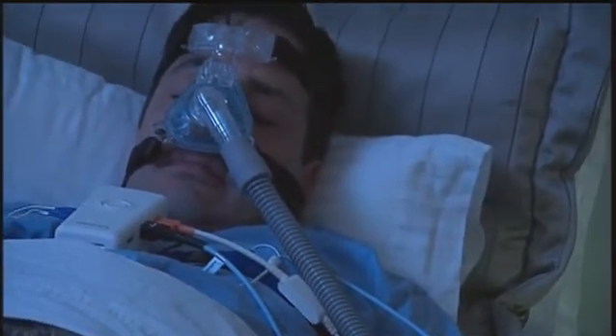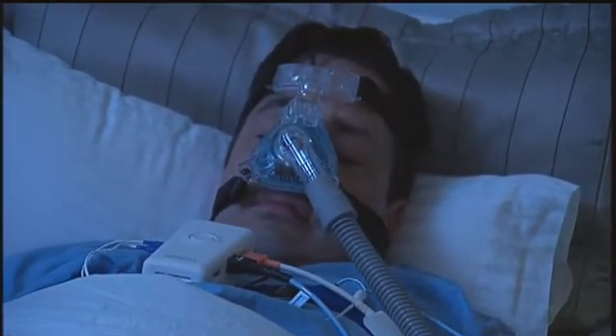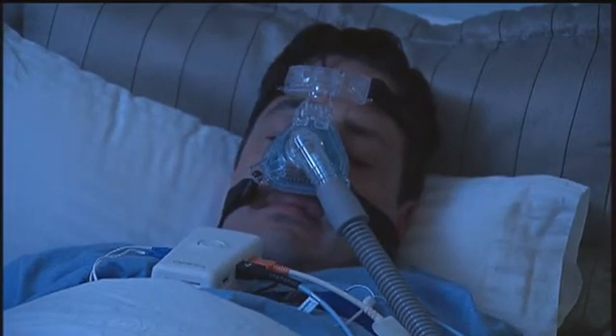You will not need to wear the nasal cannula or the thermal airflow sensor, as a mask is used instead.